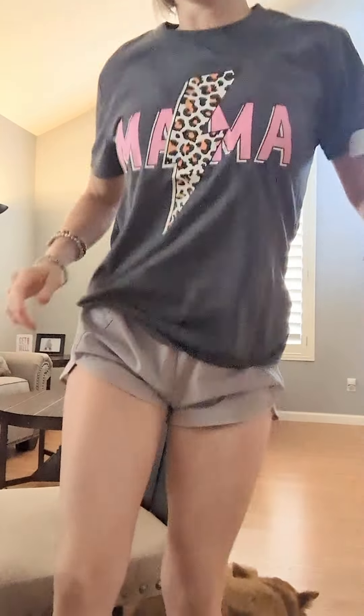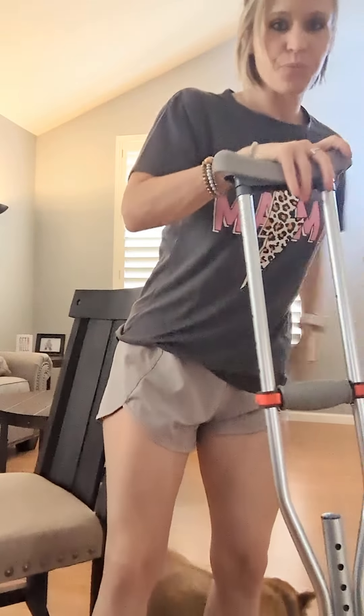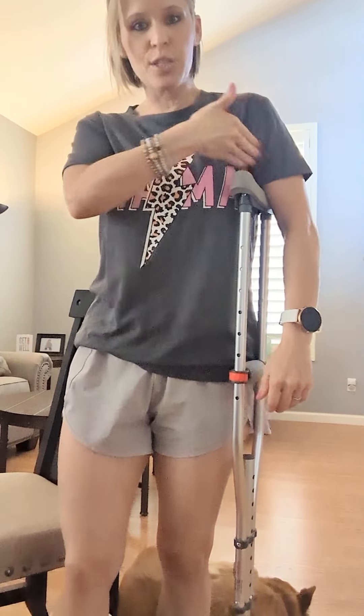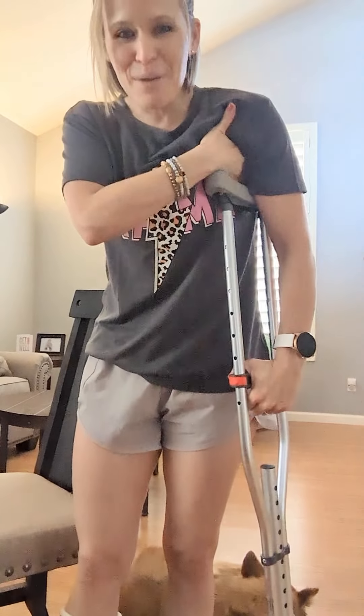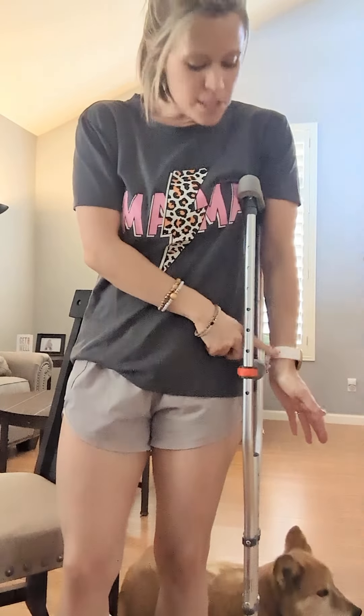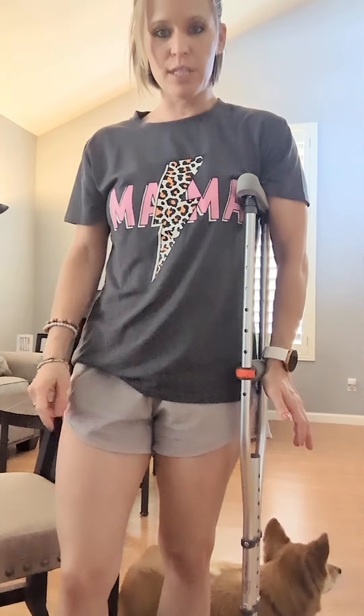So what it should look like is that in standing, your crutch should not be jammed up so high where it's in your armpit. You want to be able to wedge your hand in there. Take your hand and shove it through, and then your wrist — when you stand next to it, the crease of your wrist should be close to where the handle is.